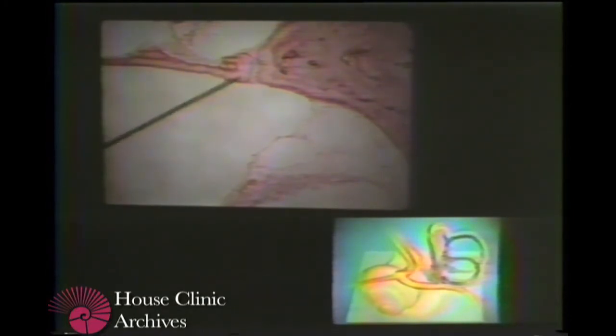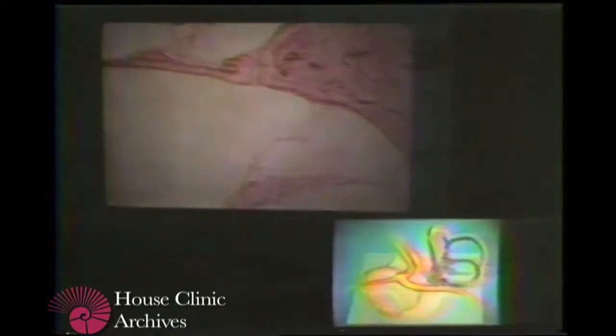The interesting point here is the proximity of the supporting structures of the utricle to the stapes. It is conceivable that when the stapes is removed, the endosteum here could pull on this and cause a disruption of the utricle. This is a vertical cut showing the proximity of the posterior portion of an otosclerotic footplate to the supporting structures of the utricle.